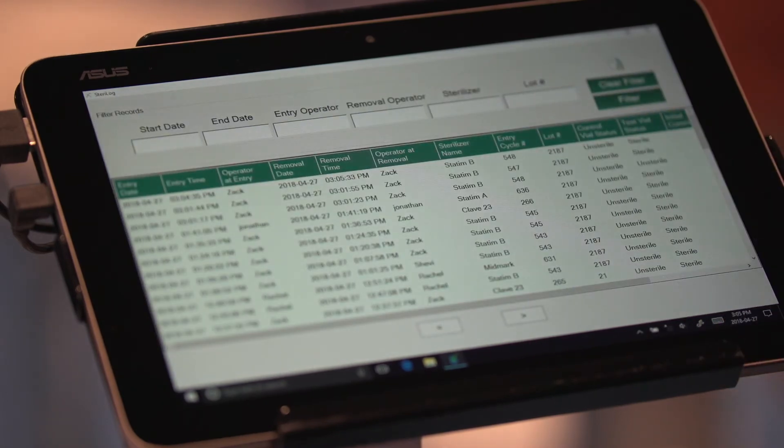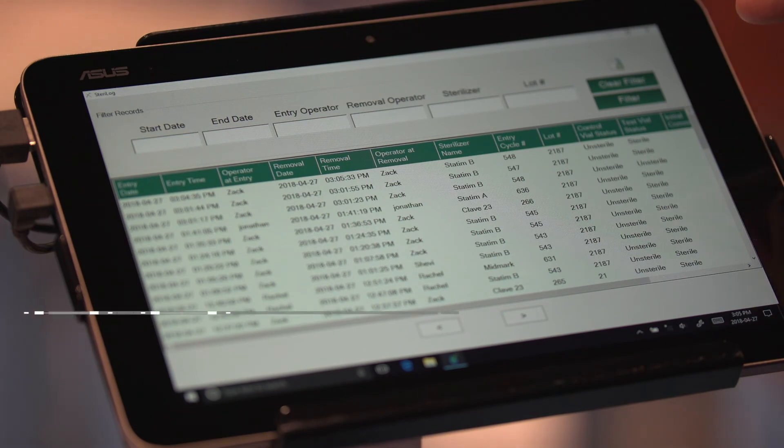Here you can see all the information. It can be exported to Excel and filtered on a specific date range. If you want more information, please contact us at our website today or reach us by phone.